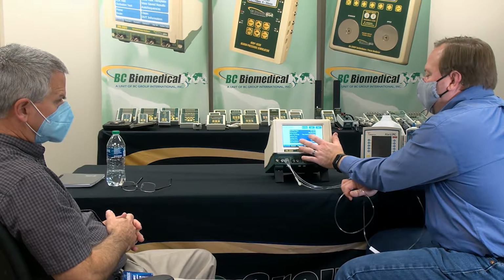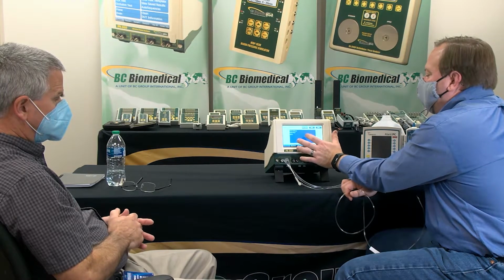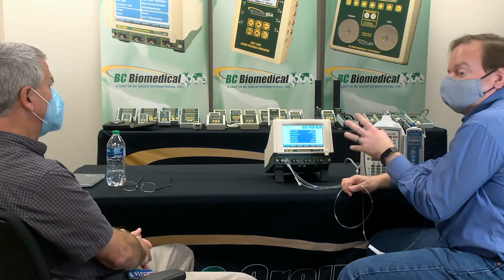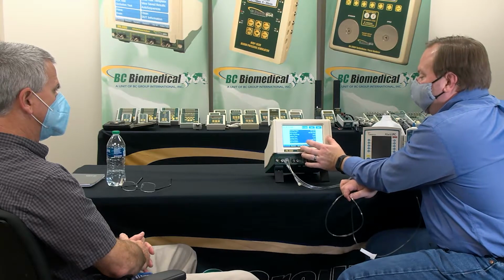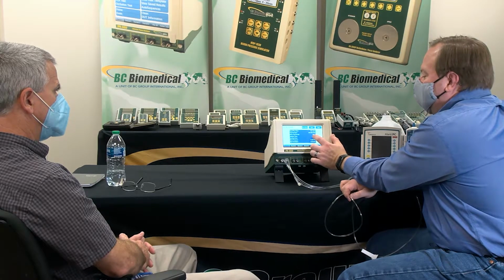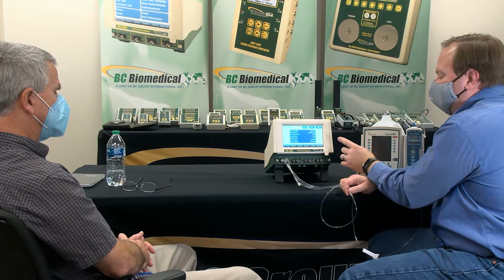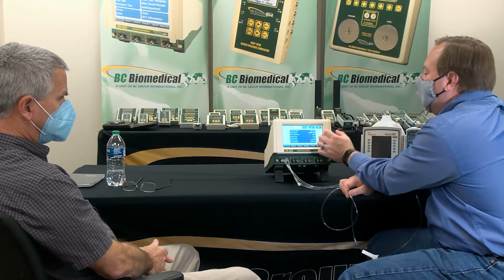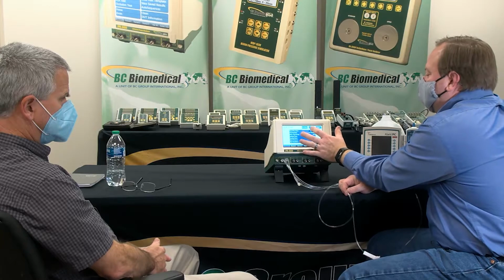Bolus test config, so this is our test parameter, we don't care. So you can do tolerance, pass fail, plus minus on each bolus. Lockout time is going to tell it how long is the time in between. If you get a flow less than that time, it's going to say it failed. But we can set it to 0 because we don't care. So let's just start the test.